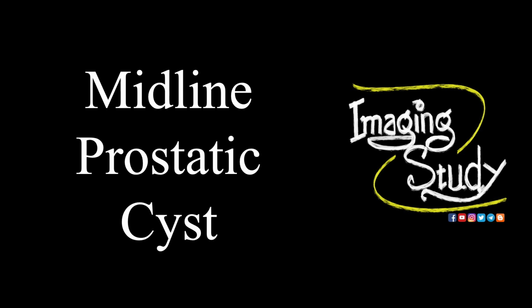Today we are going to see a case of midline prostatic cyst. This is a very common finding while practicing ultrasound, but there are some tricky parts that you should know before diagnosing this thing.